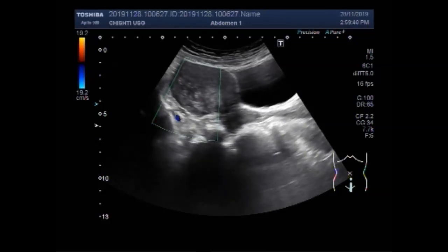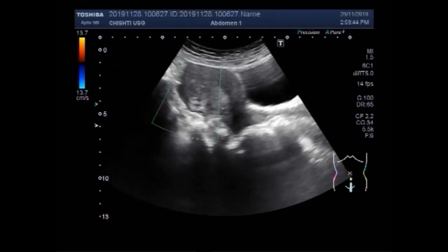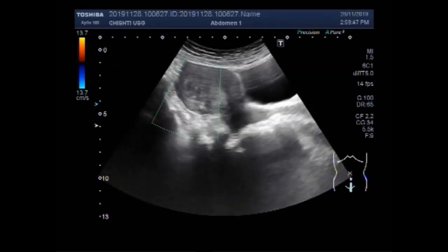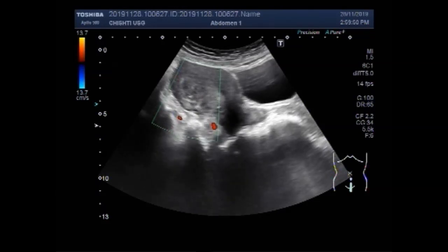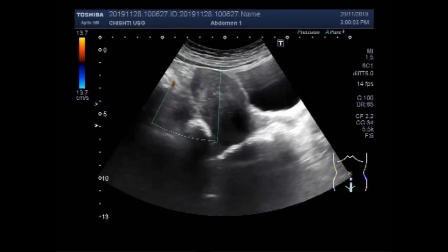Now you are going to see the distal portion of the uterus. You can see a semi-solid to solid mass in the distal portion of the uterus. This is a mass — most probably it is a fibroid.